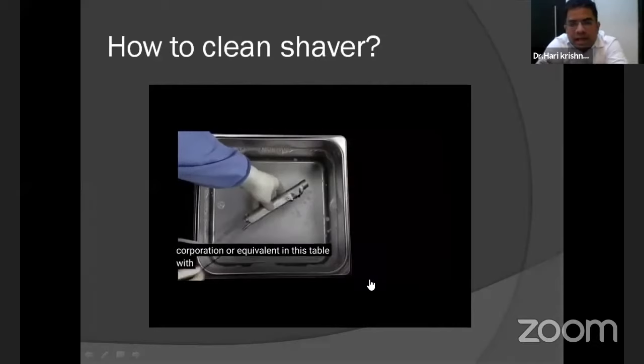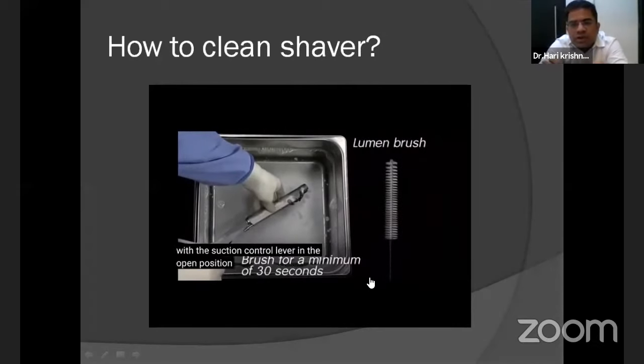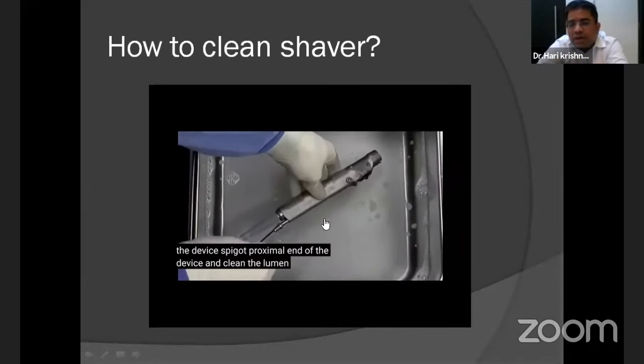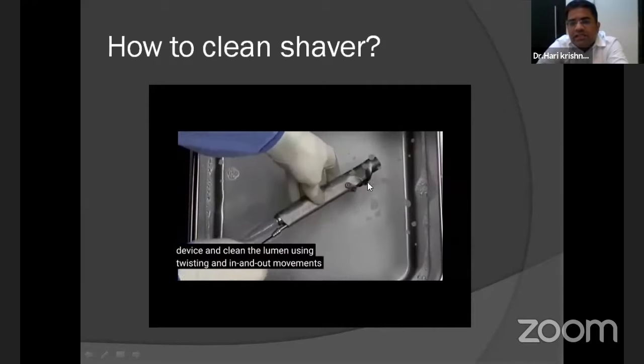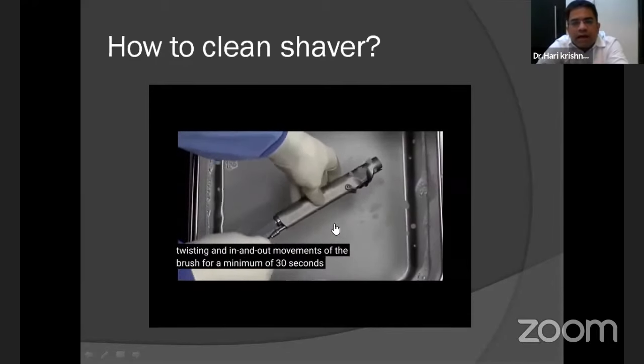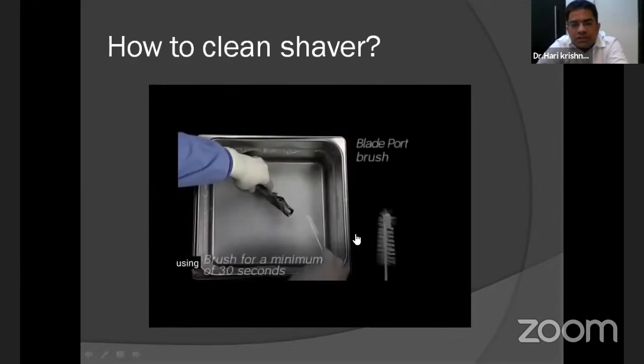See, as an orthopedic surgeon, I keep my instruments with myself, so I clean them myself. It's very important to clean your suctions and the shaver system so that it will not have a blockage and to decrease the chance of infection after each surgery. So that's what I wanted to show in this small video on how to clean your shavers.